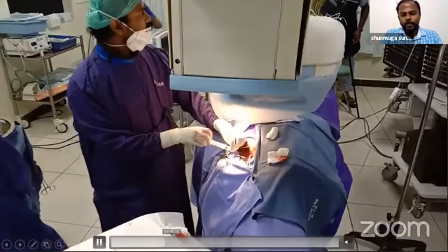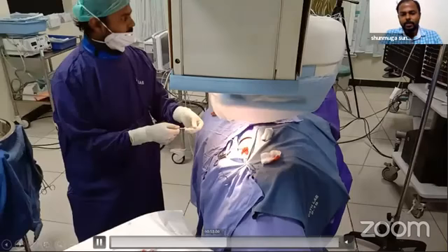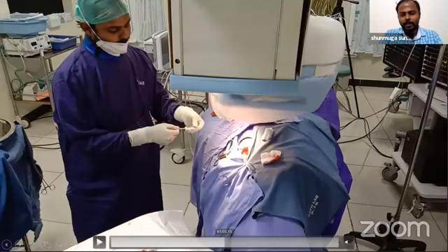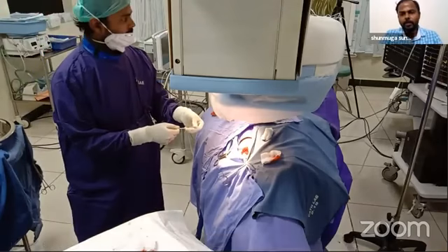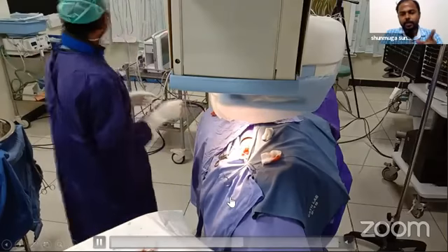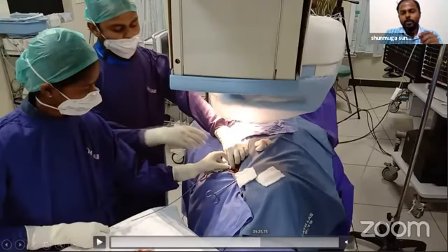And typically it is an infraclavicular incision along the line below the clavicles. And we usually take an extrathoracic left subclavian puncture. And I usually take two punctures separately. I never mix up both in the same puncture. So once the two punctures are taken, the upper one will be used for atrium and the lower one will be used for ventricle, so that your final lead positioning will be better if you are taking it that way. So for putting the sheath, like the His bundle where I was describing, you have to always have the 7 French sheath in situ, and over that it is always better to put your C315 sheath so that you can have a good control whenever you want to reshape the sheath.